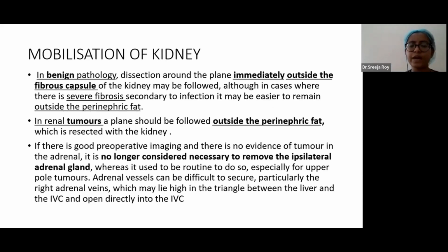Mobilization of the kidney: if it's a benign pathology, then we dissect immediately outside the fibrous capsule. If there is severe fibrosis, then we may need to dissect outside the perinephric fat. In case of renal tumors, we dissect outside the perinephric fat.